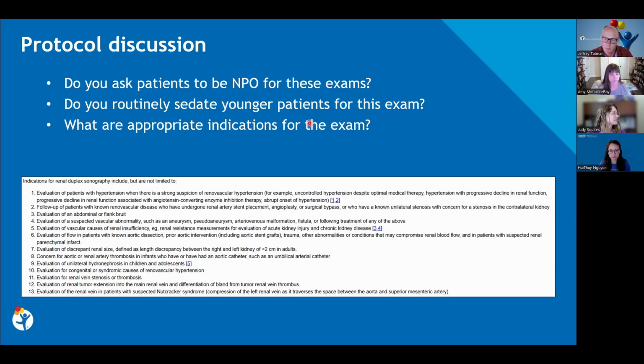We've been asked to combine, like, a kid has an MRI for some reason, and then they come out of sedation and we're asked to do the study immediately following. And I find that is worse because the patient is always coming out of anesthesia and they're fighting you even more. But we will never purposefully sedate only for the purposes of any ultrasound, ever.